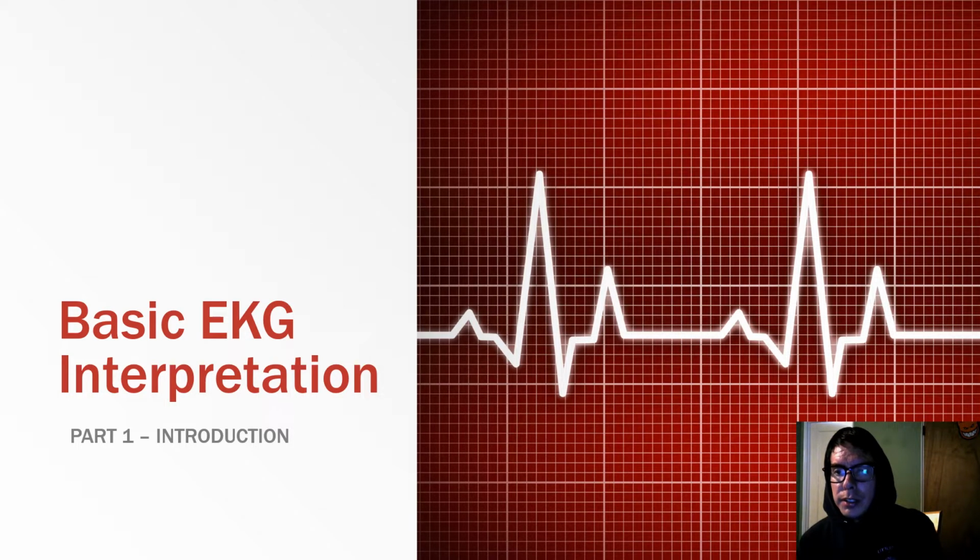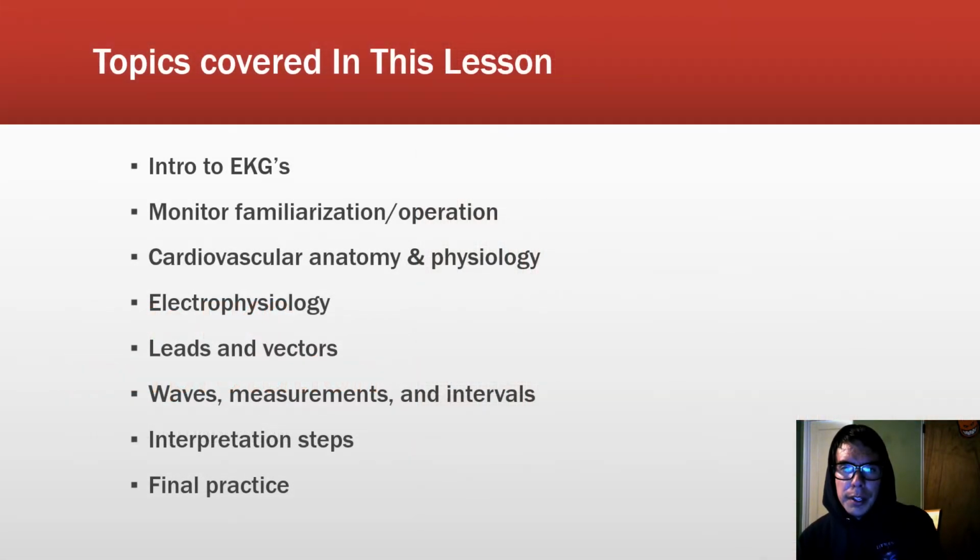So anyway, let's get started. In this video, we're going to cover an intro to EKGs, monitor familiarization and operation a little bit, cardiovascular anatomy and physiology, electrophysiology, leads and vectors, waves, measurements, and intervals, interpretation steps, and then we're going to practice those steps on some tracings at the end.